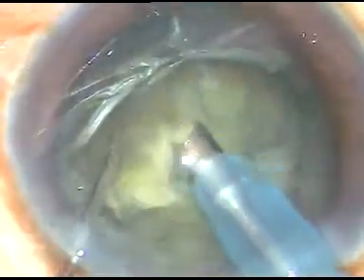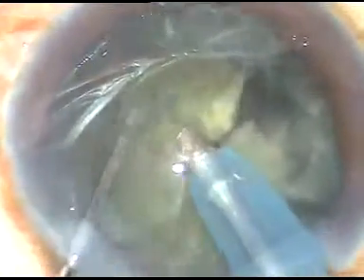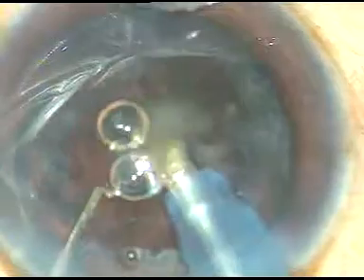Then I rotate the nucleus again and make another chop. The nucleus is not very hard — it is soft. You may see it is grade 3 nucleus sclerosis. I am able to hold the nucleus quite firmly. In this case, the phaco power used was 60%, flow rate was 45ml per minute, and vacuum is 450mmHg. You can see the anterior chamber is very stable. There is no surge. The air bubble is not moving much, showing there is not much turbulence in the anterior chamber, and I am quite far from the endothelium.